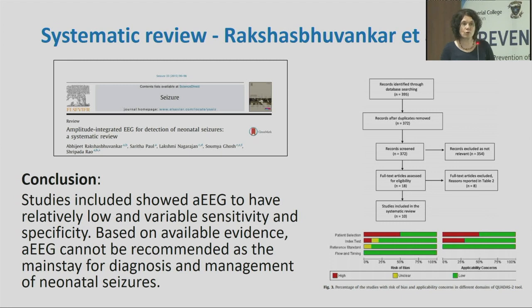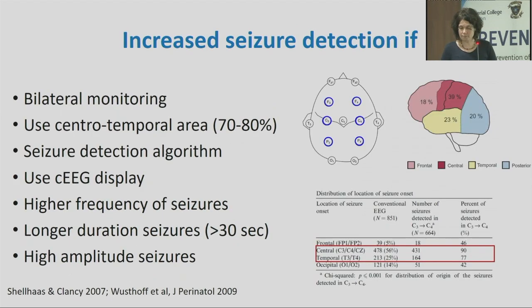I think with raw channels it is relatively good, but obviously not the same as if you use full EEG. Full EEG is the gold standard, but next comes aEEG with 2 raw channels.